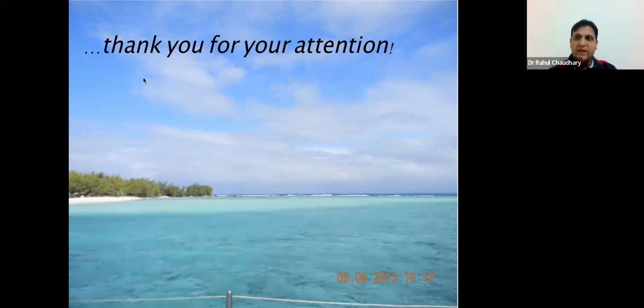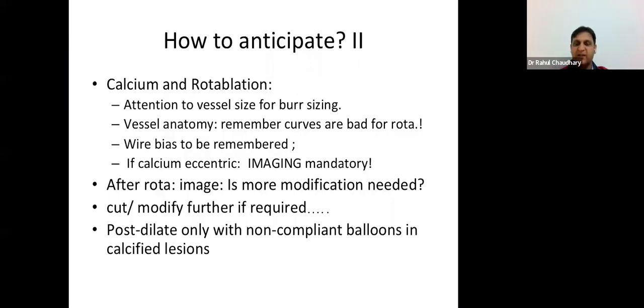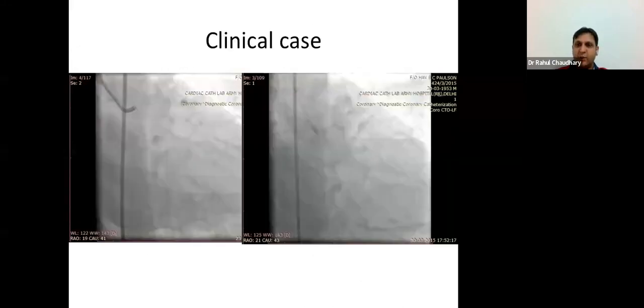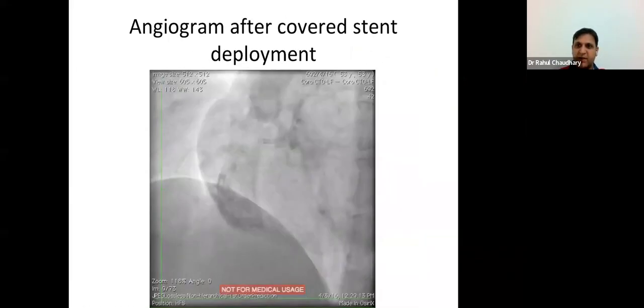I think one thing is very clear, as you very highly suggested: once you have hardware inside, no protamine. So that's pretty clear. If you implanted a stent and landed up with a perforation, no protamine. That has to be stated, I think, because there's some confusion.